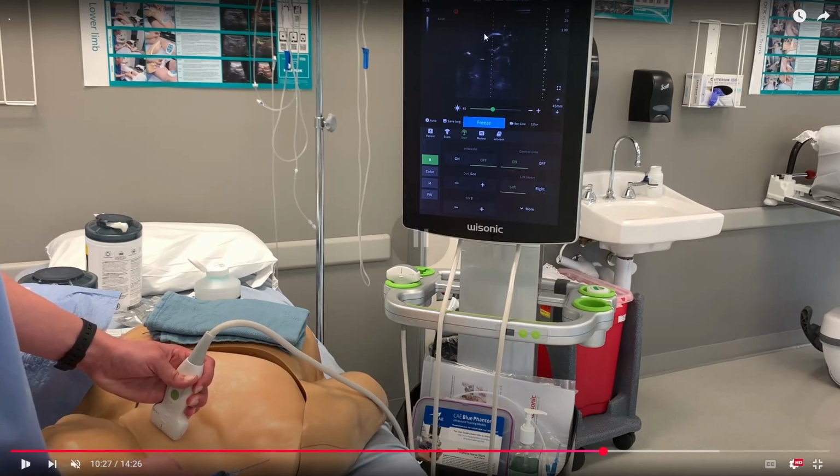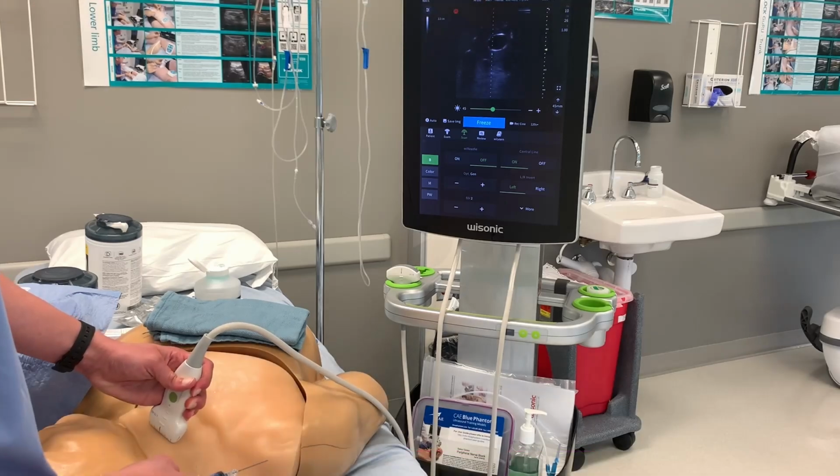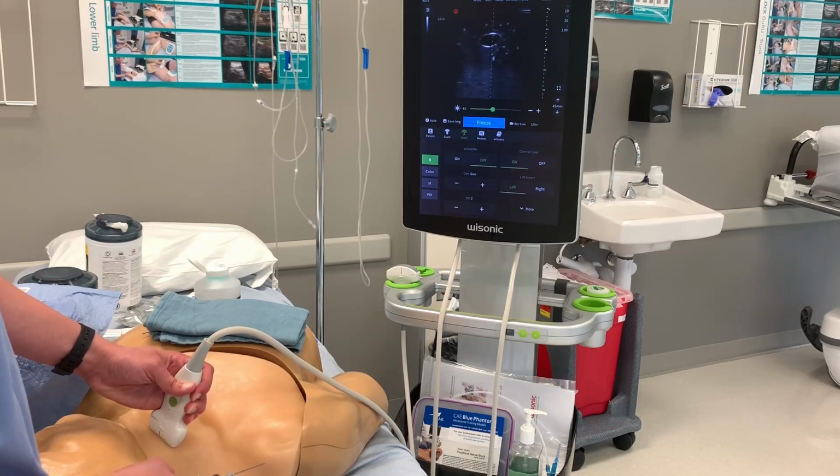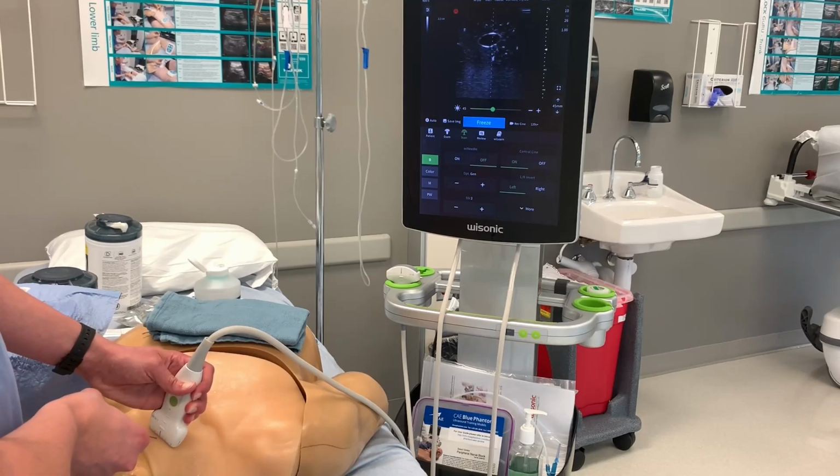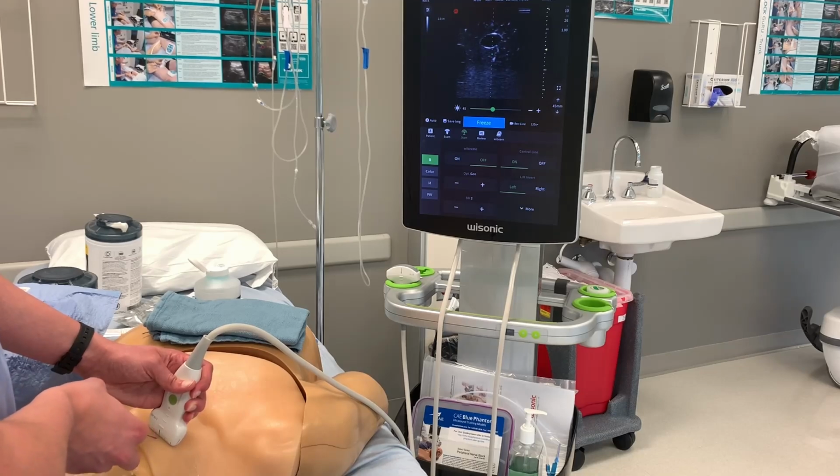So what I'm looking at is I'm looking right here. You see this circle? That is my target. All right, so again, that is going to be the right internal jugular vein. So I have my syringe. I'm going to put it just beneath the skin, and I'm going to pull negative pressure, basically making a vacuum.